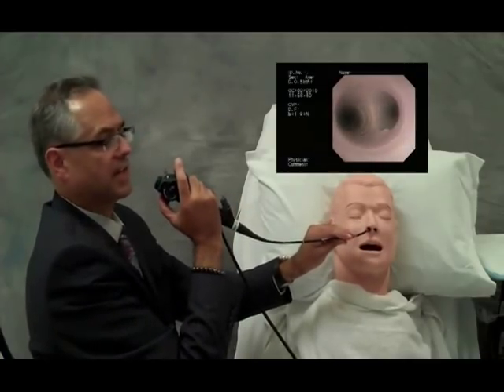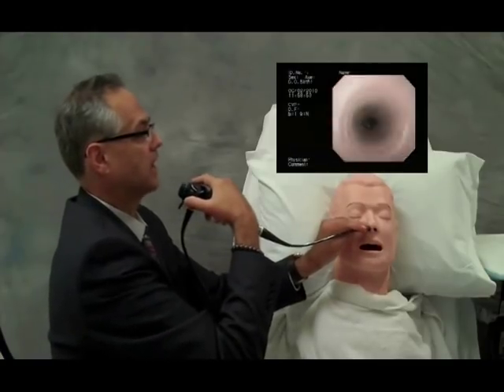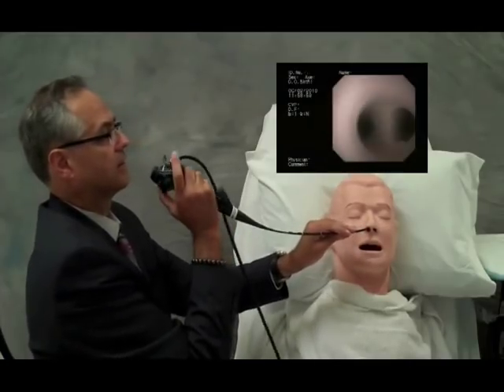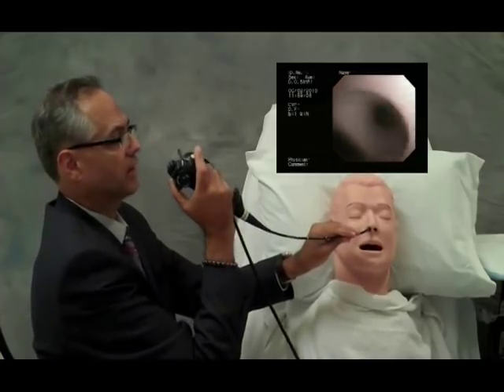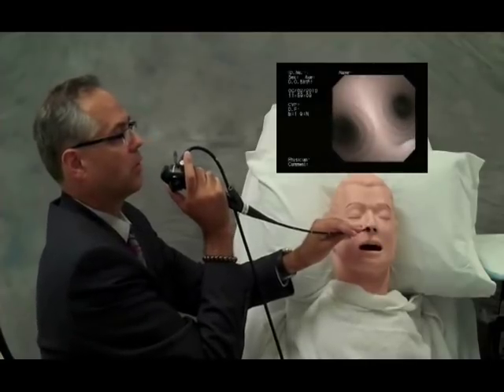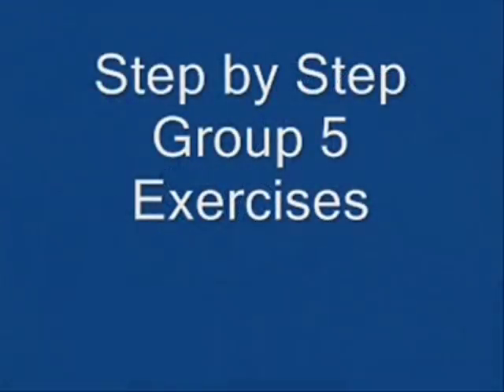Another technique is full rotation of the wrist — right side, left side, right side. Notice the complete rotation of the wrist to go down the left side. Always keeping the scope at the midline.